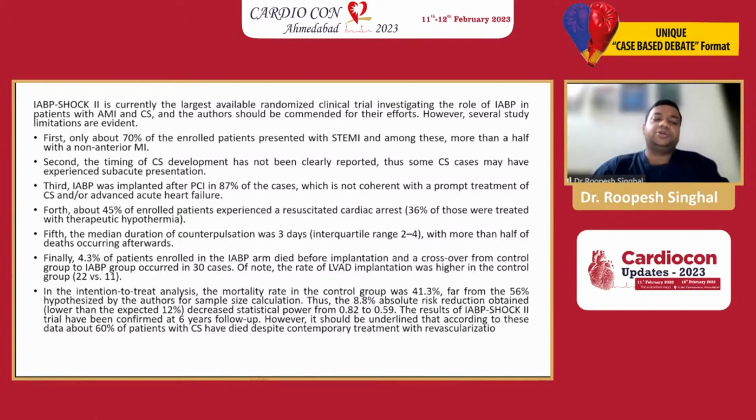The timing of cardiogenic shock development has not been clearly documented in this study. IABP was implanted after the PCI in almost 90% of cases, which is not what is recommended. We all now recognize that IABP insertion prior to the PCI may help, or for that matter, even Impella insertion prior to the PCI helps more.